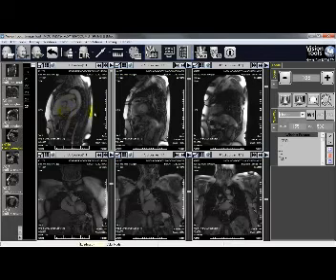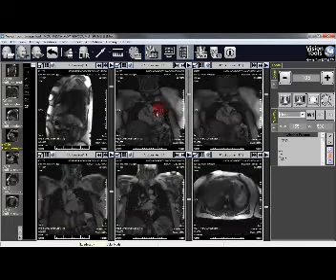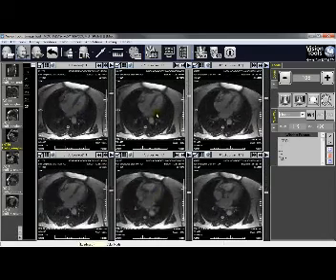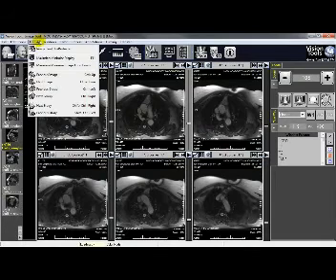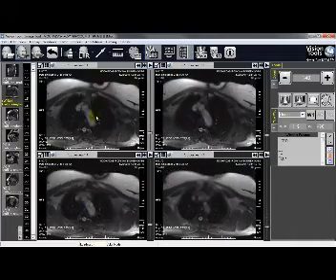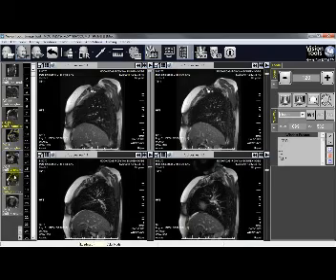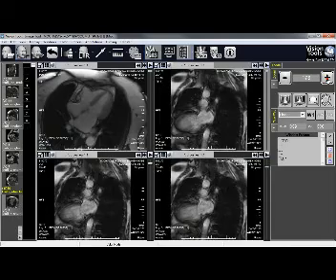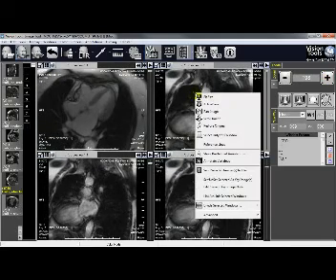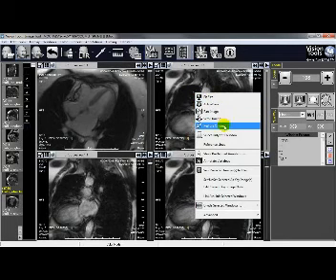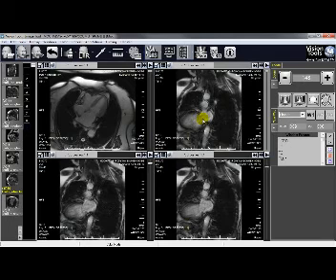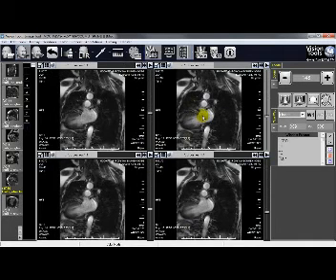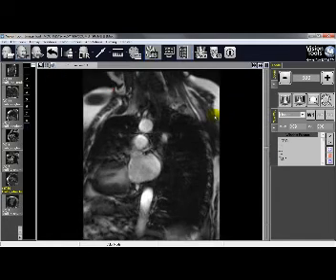The new interface has tools on the right and series on the left, with the main browser in the middle. Browse images with the mouse wheel, format the screen into multiple windows, and select another series by drag and drop. You can zoom with a button click or right-click to access the pop-up menu and use Fit Size to zoom out the images.